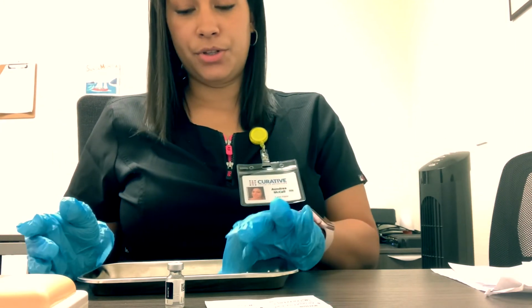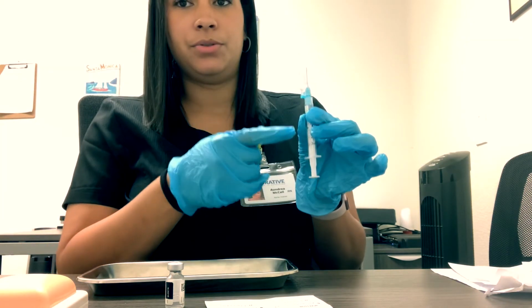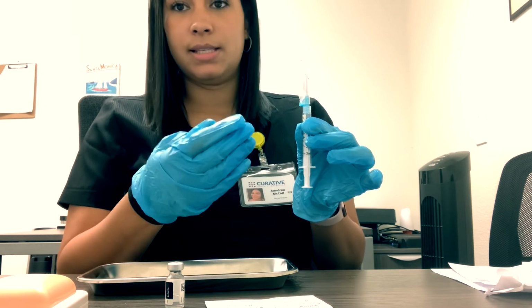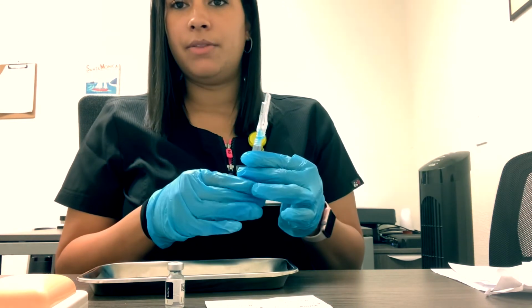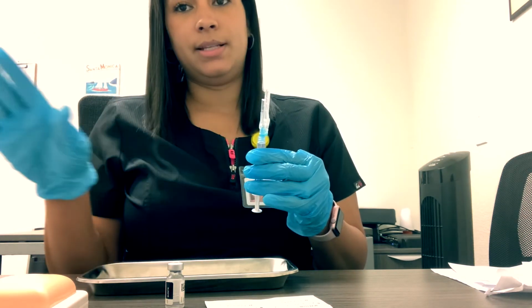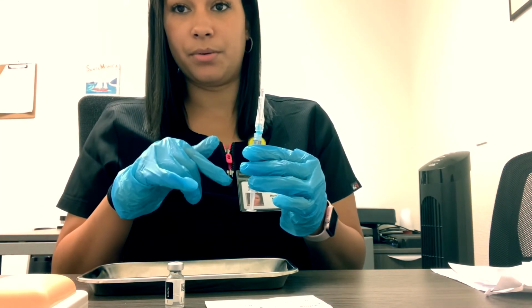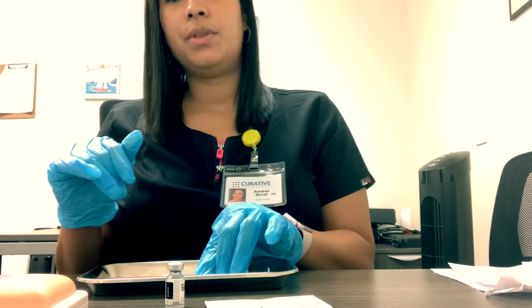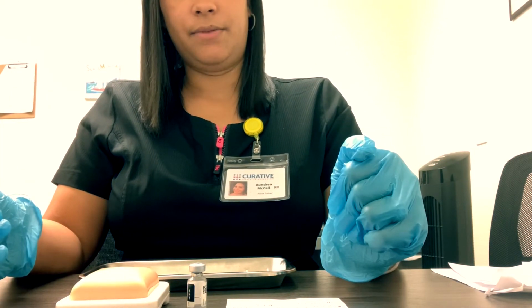As the administering nurse, it is your job to verify that your dose is correct once it is handed to you, so this would be considered the second check. So you would check to make sure that in fact you do have 0.5 mLs. This is a viral vector vaccine, so the color should be clear to slightly yellow. If anything were wrong with it, then you would go ahead and just simply send it back to the prep station. Once you verify that your dose is correct and everything looks fine, you will then go ahead and screen your patients. Also make sure that they do give consent to getting vaccinated.